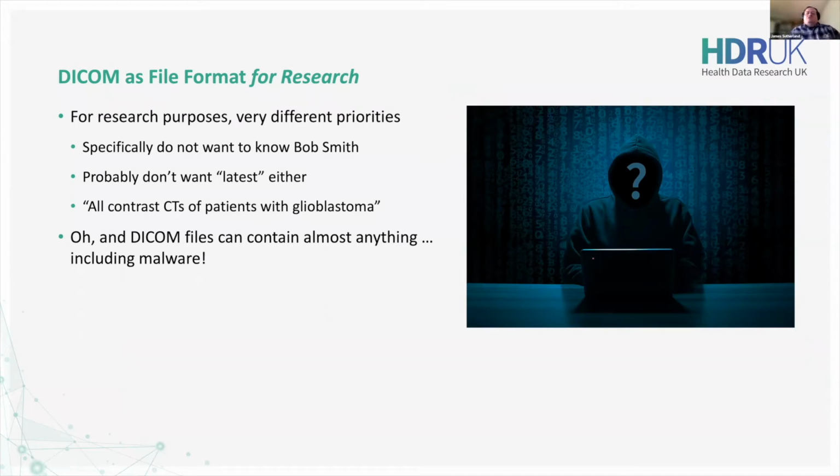So as a researcher, you might want all the contrast CTs of patients with a glioblastoma. Well, that's fine, except the PACS doesn't know about glioblastomas. That's a diagnosis. That's not the PACS's job. So we need to link to external databases. So in that case, for example, there's a cancer database which records when a patient is diagnosed with a particular condition.